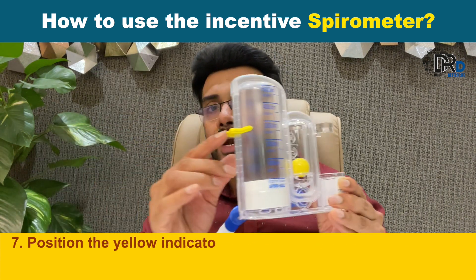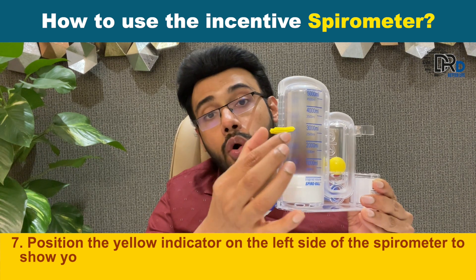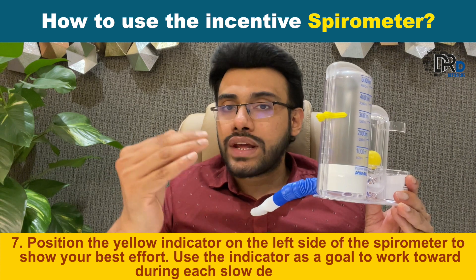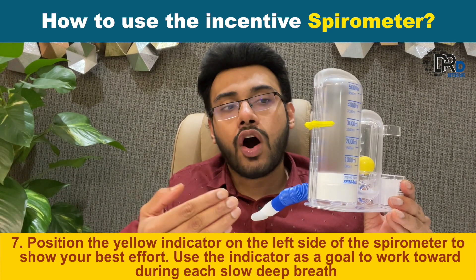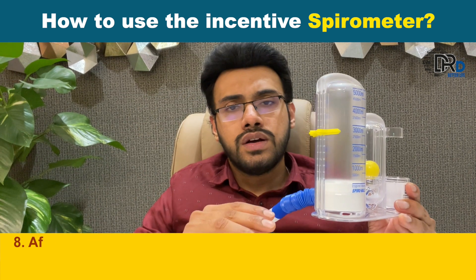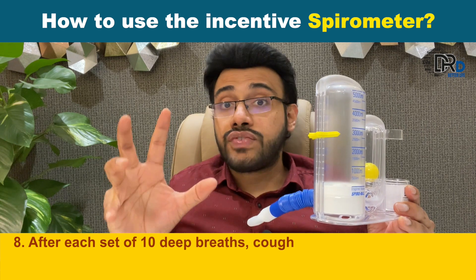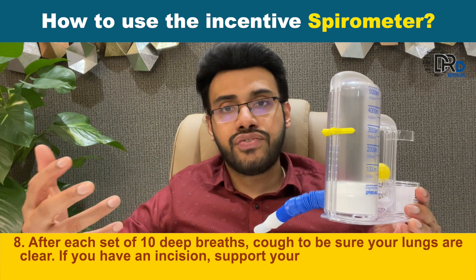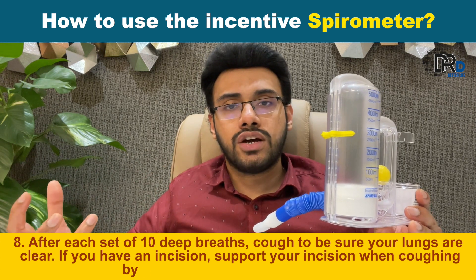Position the yellow indicator on the left side of the spirometer to show your best effort. Use the indicator as a goal to work towards during each slow deep breath, to see how much you can improve. After each set of ten deep breaths, you can cough to make sure your lungs will be clear, and then spit out.